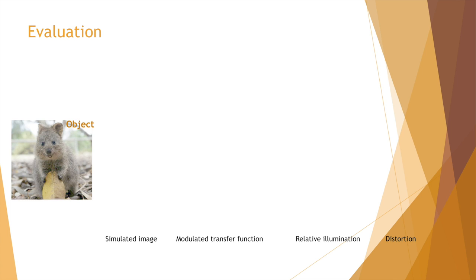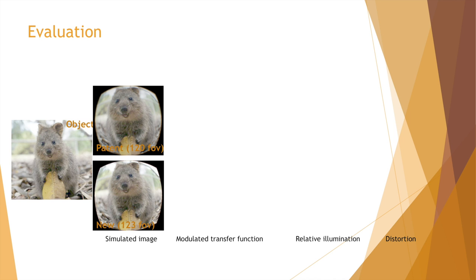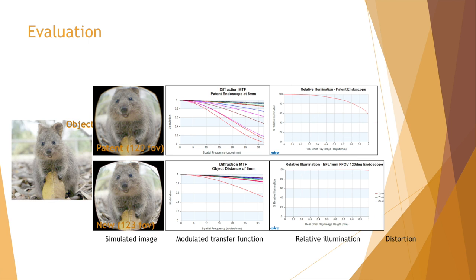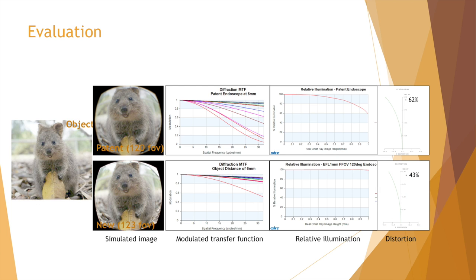Here is a comparison between the patent lens and the new lens design. With the patent lens having a 120-degree full field of view, the new lens achieves 123 degrees. At the same number of line pairs per millimeter, contrast improves significantly. The relative illumination remains uniform across the entire field for the new lens, while for the old lens the brightness drops quickly starting from the half-field point. The new lens also has much less distortion, which is very beneficial for accurately locating lesions with higher resolution and more brightness across the whole field.